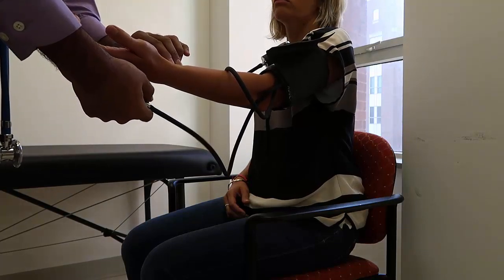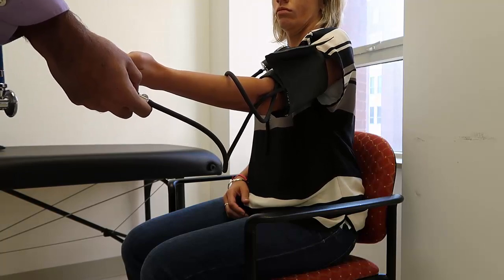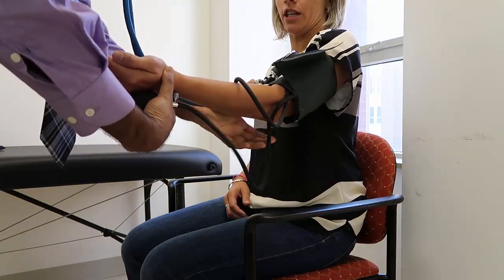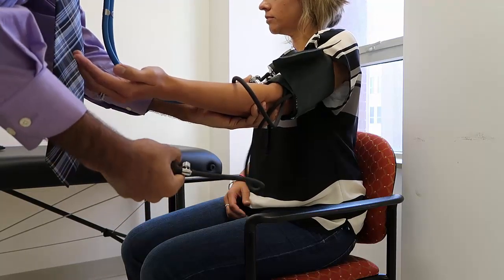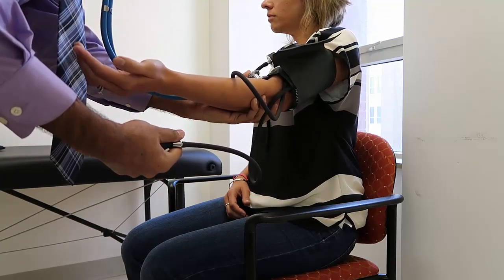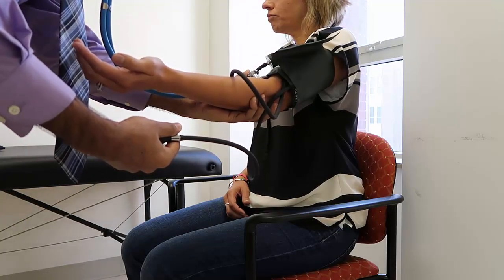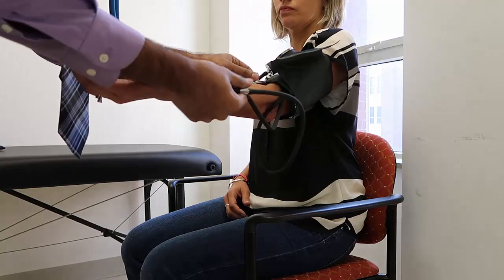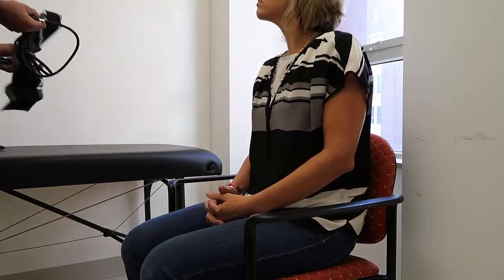I felt the pulse at around 96 and then it disappeared, so I'm going to pump it up about 20 to 30 above that. I'm just going to grab my stethoscope. I'll adjust your arm to make sure it's not too high. Is the stethoscope too cold for you? No, feels good. I'll support your arm as I do this. So I heard your blood pressure — 102 systolic and around 68 for your diastolic. Is that normal for you? It is. Because that's something you're used to, I'm not concerned about your blood pressure.